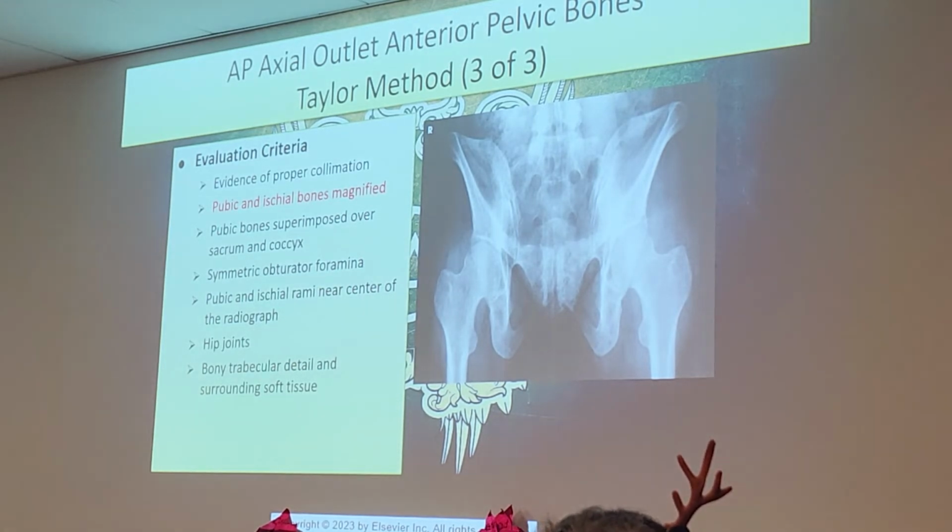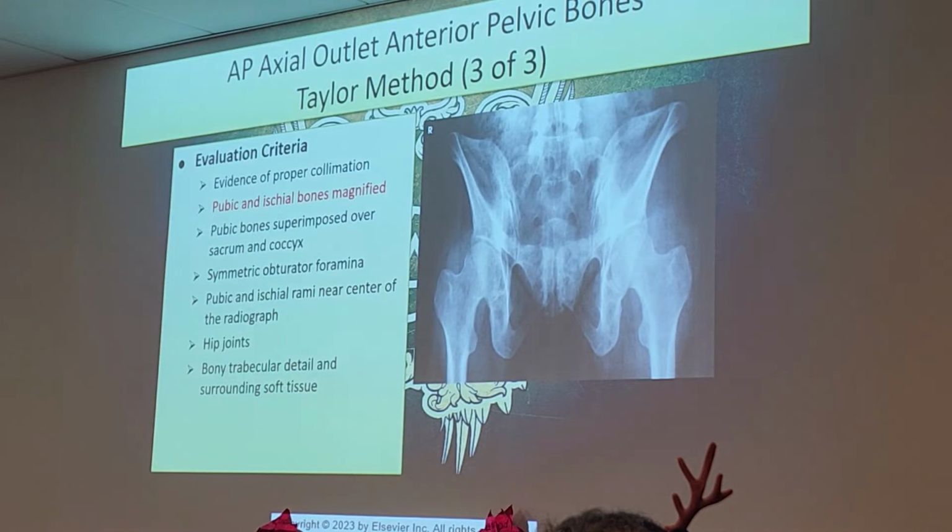So, did this patient turn their feet in? Yes or no? No. They did not. It's not part of the positioning, but how can you tell they didn't turn their feet in? Lesser trochanters are very visualized. Good.